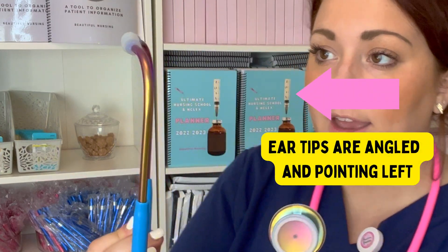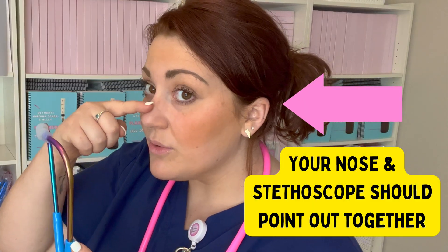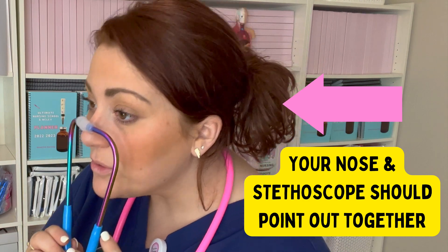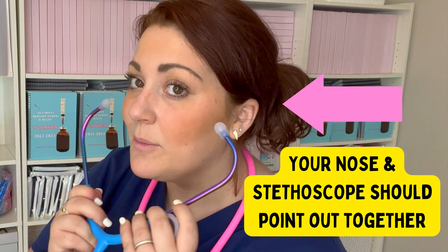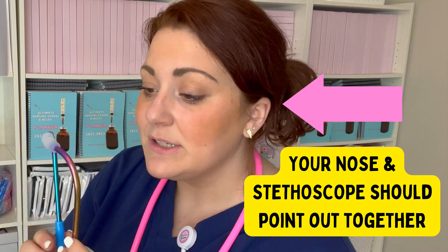Let me teach you something too. When you are listening with a stethoscope, one of the biggest mistakes someone can make is putting them on the wrong way. It can be hard to know which way to listen in. If you look from the side, you'll notice that the stethoscope is kind of angled. If you see how my nose is pointing out, I want my nose and my stethoscope to both be pointing out — that is the way to apply your stethoscope. Just remember you want it pointing out, and that is how you're going to get the most clear sounds.